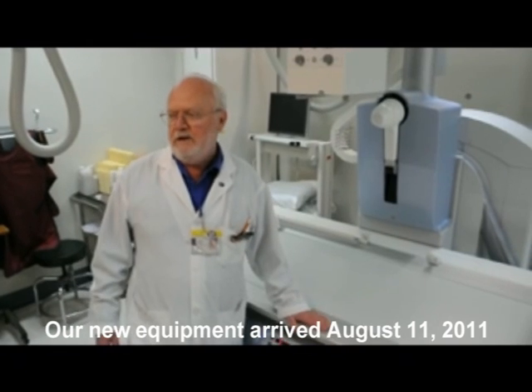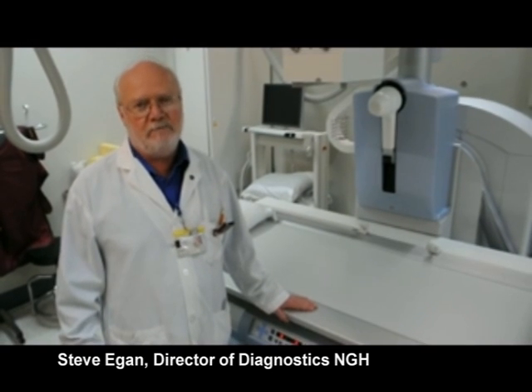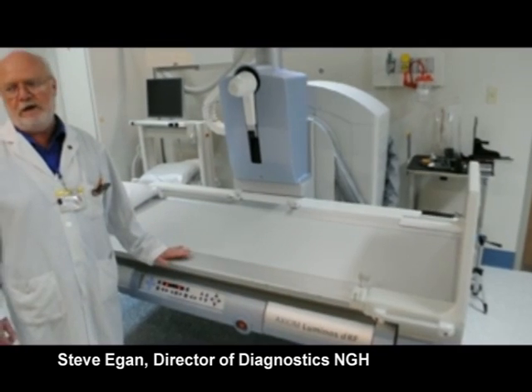Hi, I'm Steve Egan, Director of Diagnostic Imaging at Norfolk General Hospital. This is our new suite. This was a long process. First of all, we had to get the money from the community. Thank you so much from the entire Diagnostic Imaging Department — this was a long project.